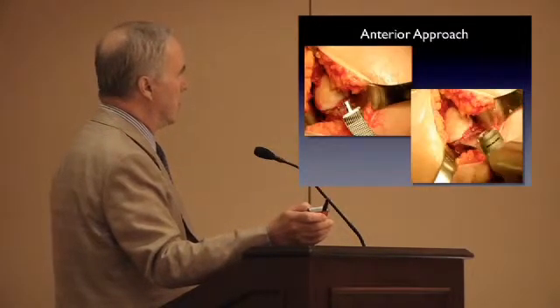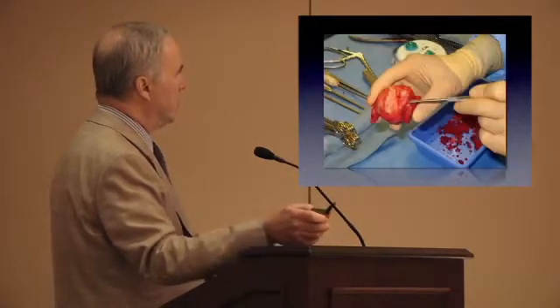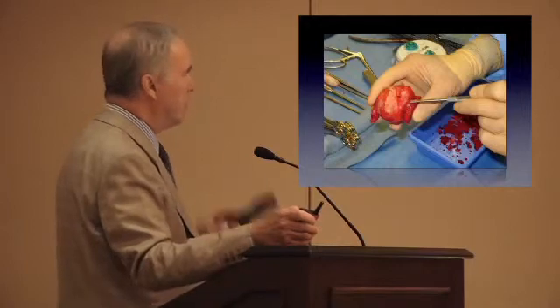Here's John's anterior approach osteotomy. The other thing I do is look at the head and look at the osteophytes, and we'll talk about those later, but it's important to resect the remaining neck osteophytes if they've grown down the neck some.